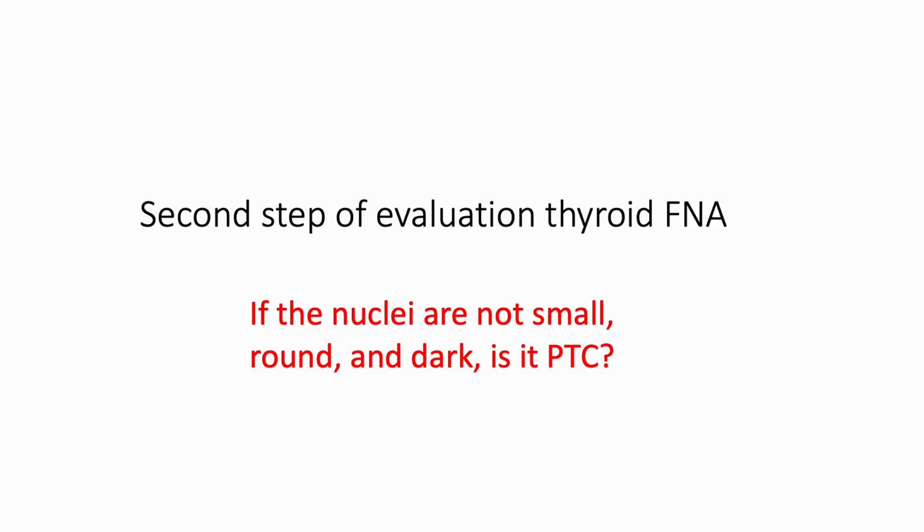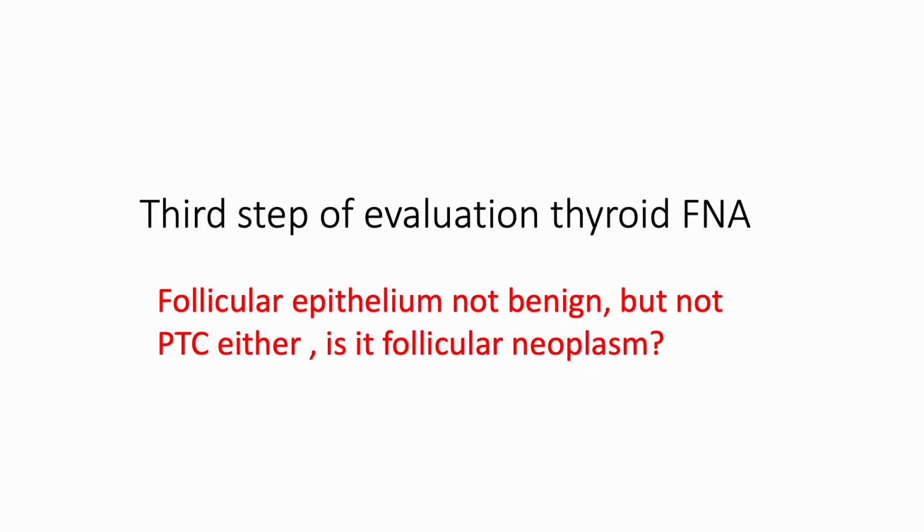Could this be papillary thyroid carcinoma, PTC? PTC nuclei show characteristic cytologic features. Cytology can diagnose PTC accurately. If you are not familiar with benign thyroid or PTC, please watch my previous 2 videos. If it's not benign and not PTC, the third step is to ask: is this a follicular neoplasm?